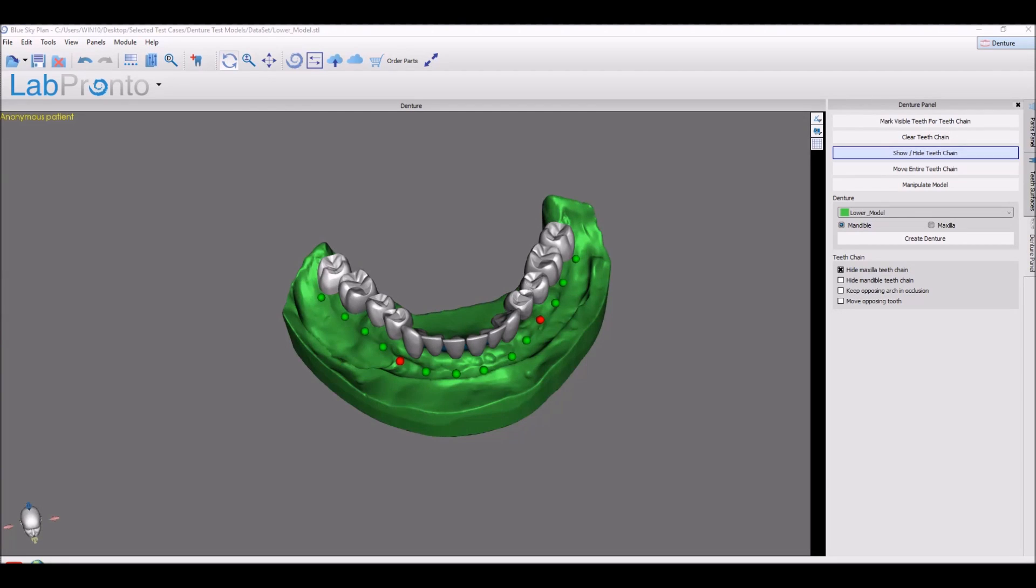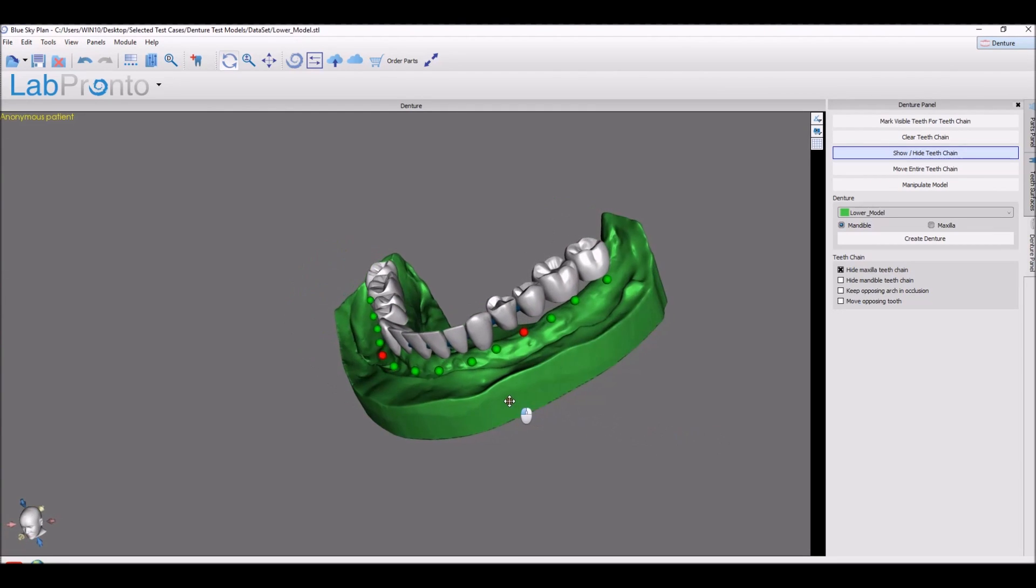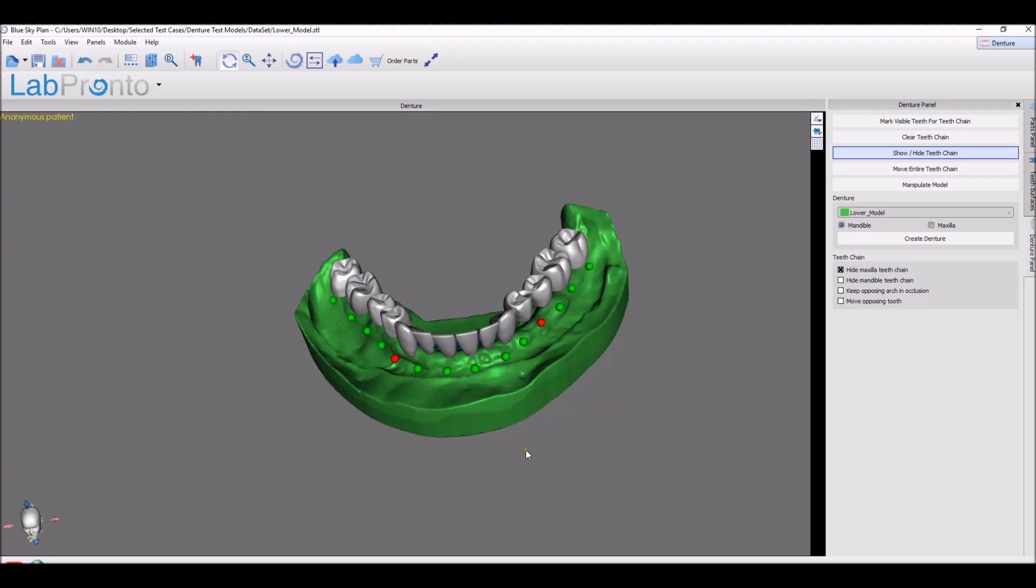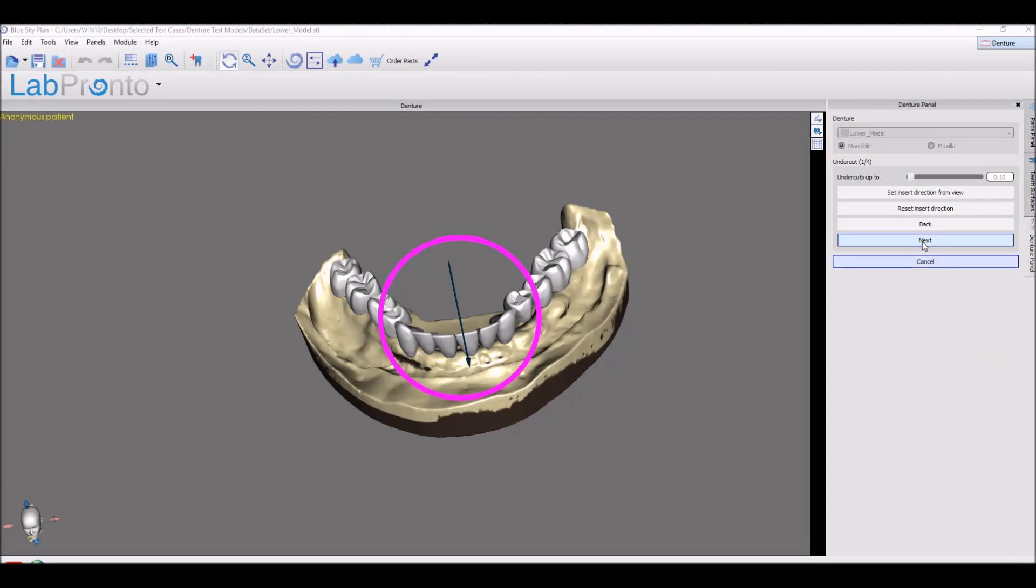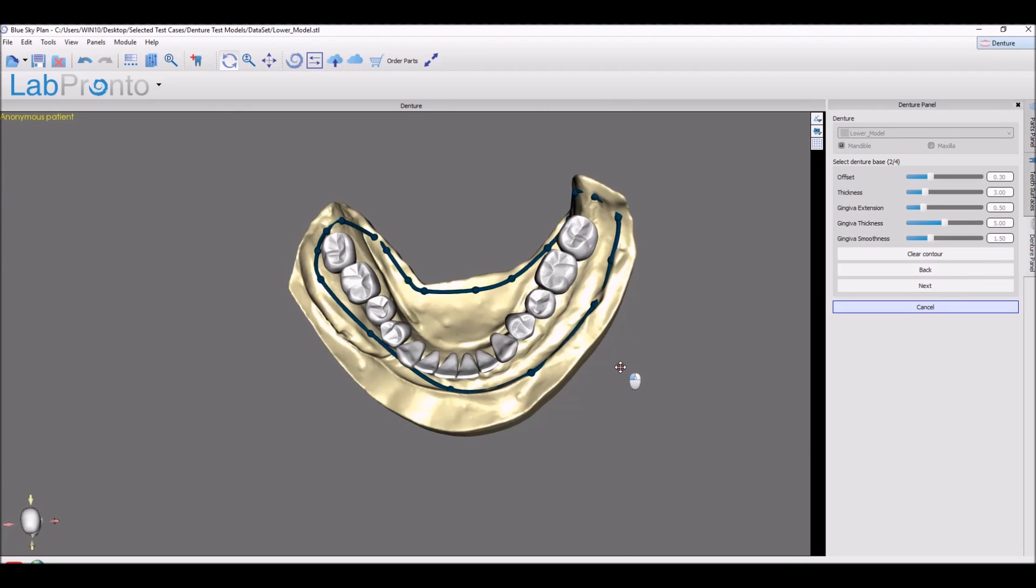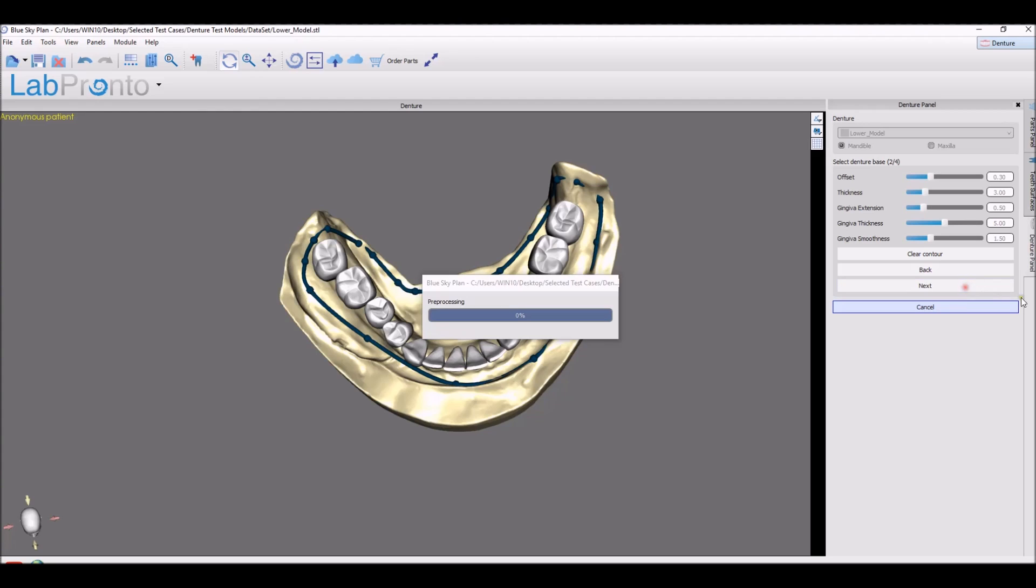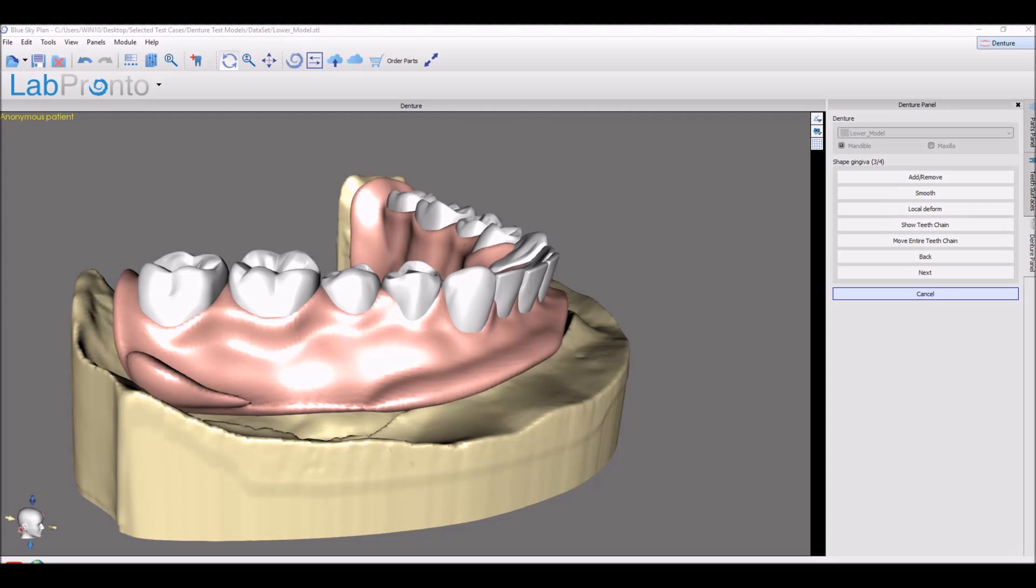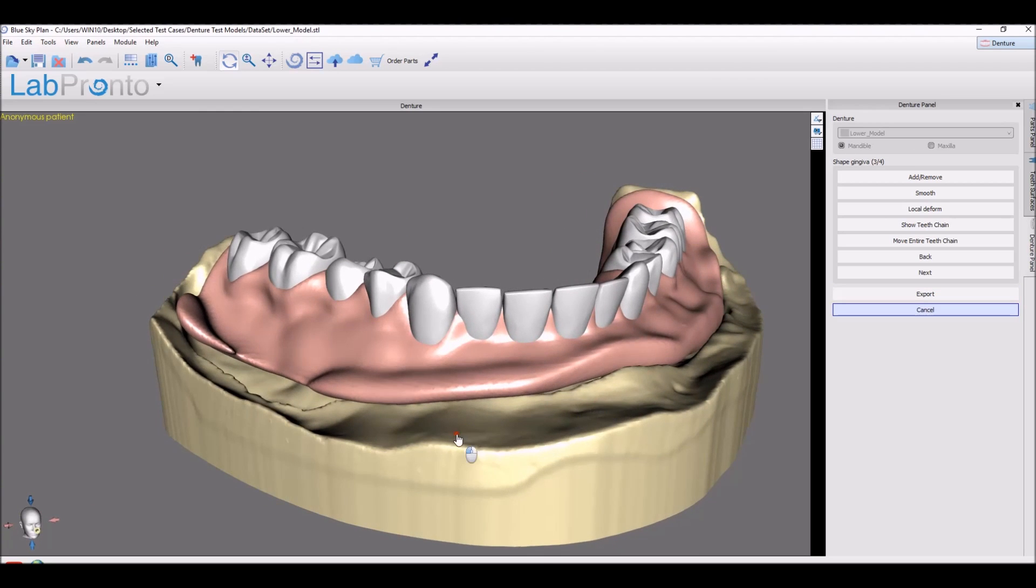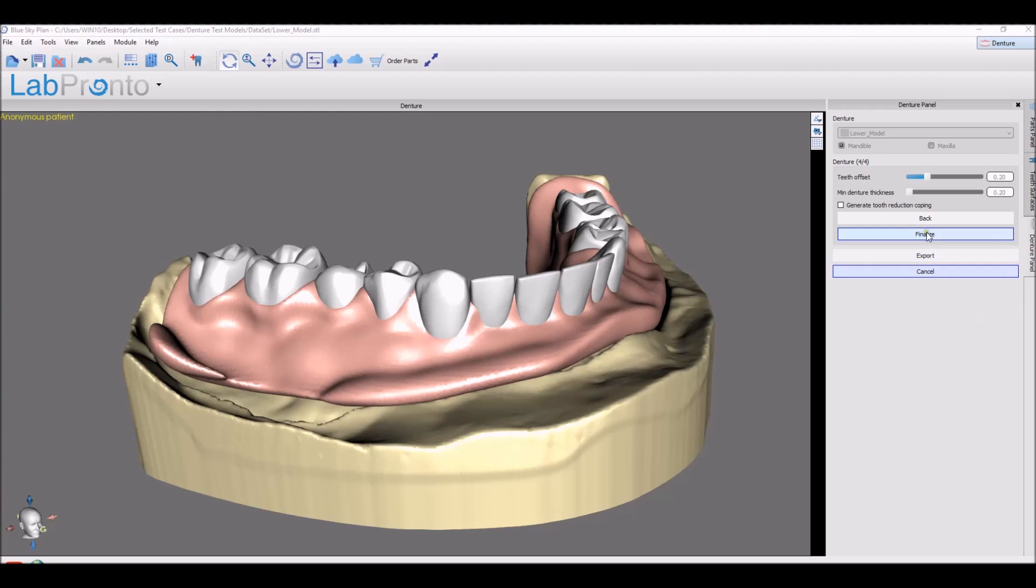We have simplified the denture fabrication process. After you position the models with the teeth, it's a very straightforward and simplified process. Determine your undercuts. Step two is to define the denture base. And we can see the improved gingiva contour created automatically by the software allows us to further edit the gingiva using the tools. And step four is finalizing, selecting a reduction coping and exporting. And that's it.